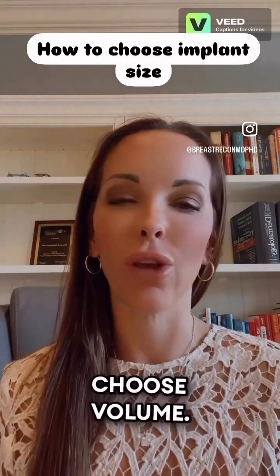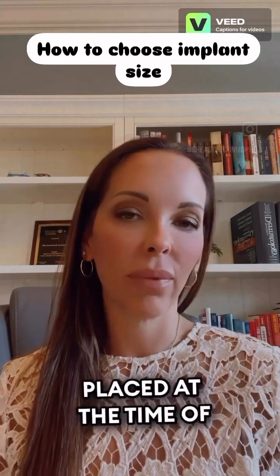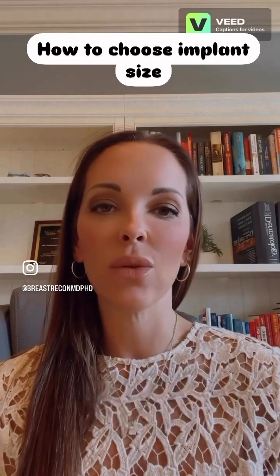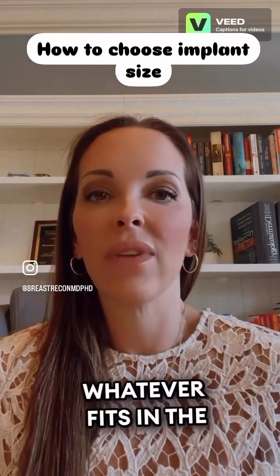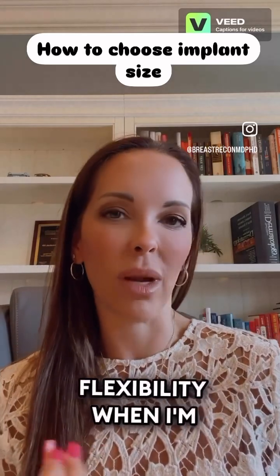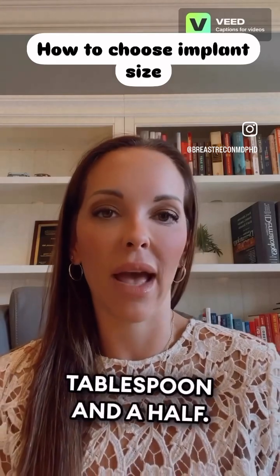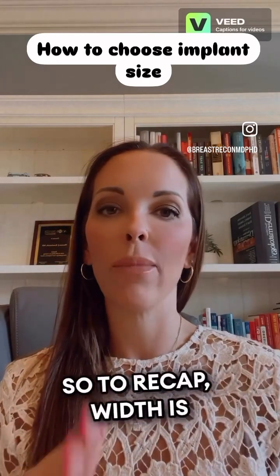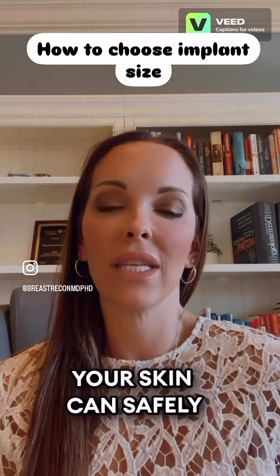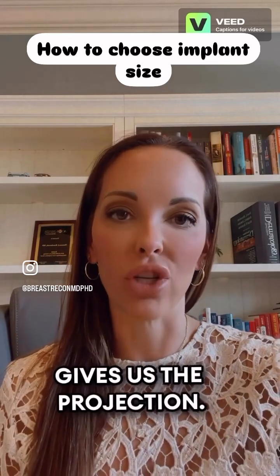Then we choose volume. How do we choose volume? It's just whatever fits, whether or not it's placed at the time of the mastectomy or in a second stage approach where we're taking out tissue expanders. It's just whatever fits in the skin. So I don't really have a lot of flexibility when I'm choosing volume, maybe 50 cc's, which is like a tablespoon and a half. So to recap, width is based on your anatomy. Volume is based on whatever your skin can safely cover. And that gives us the projection.